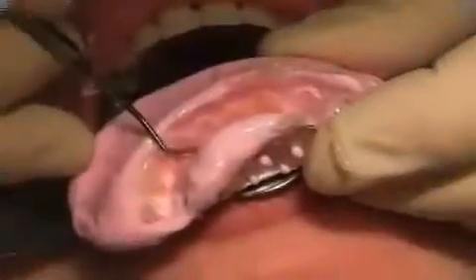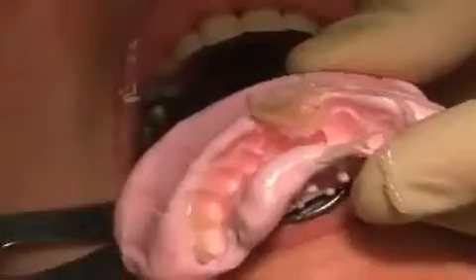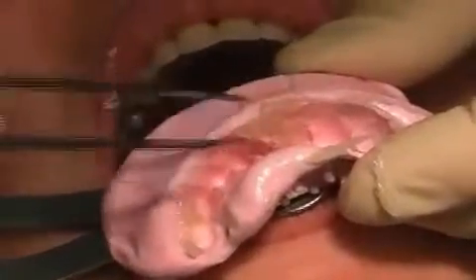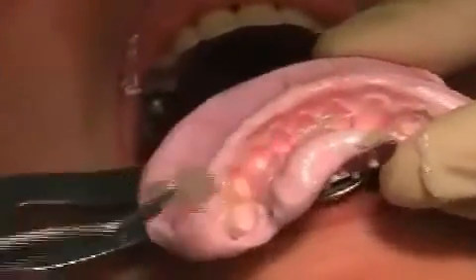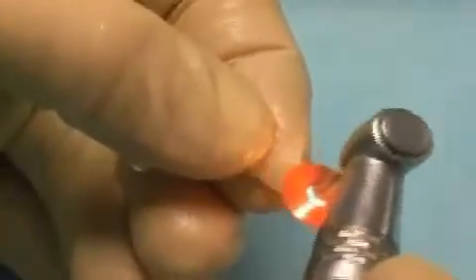At the end of the tooth preparation, an impression and a bite registration are made. The provisional solution uses plastic veneers that are made immediately after the impression is taken. A pre-impression, which was made prior to sanding, is filled with plastic and placed over the sanded teeth. The provisional solution is tried on after it is hardened, is carefully refined, and finally attached to the patient's mouth.